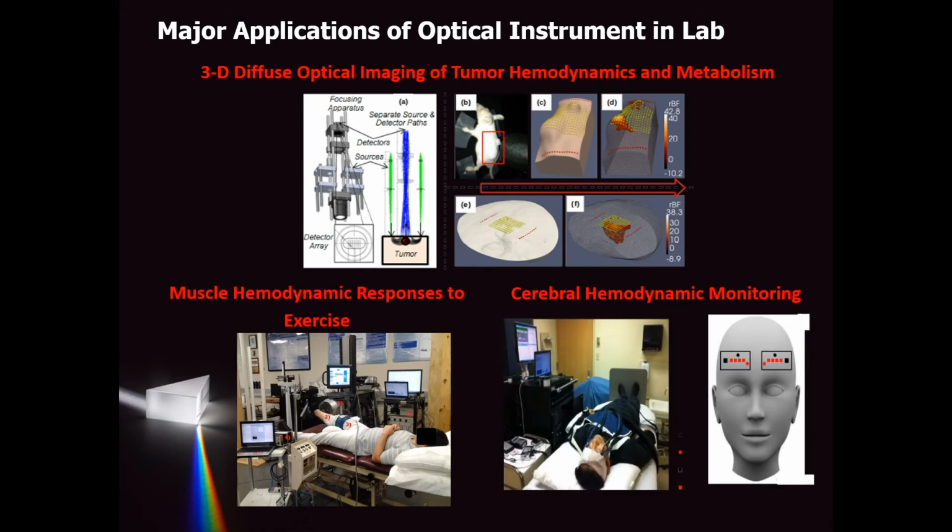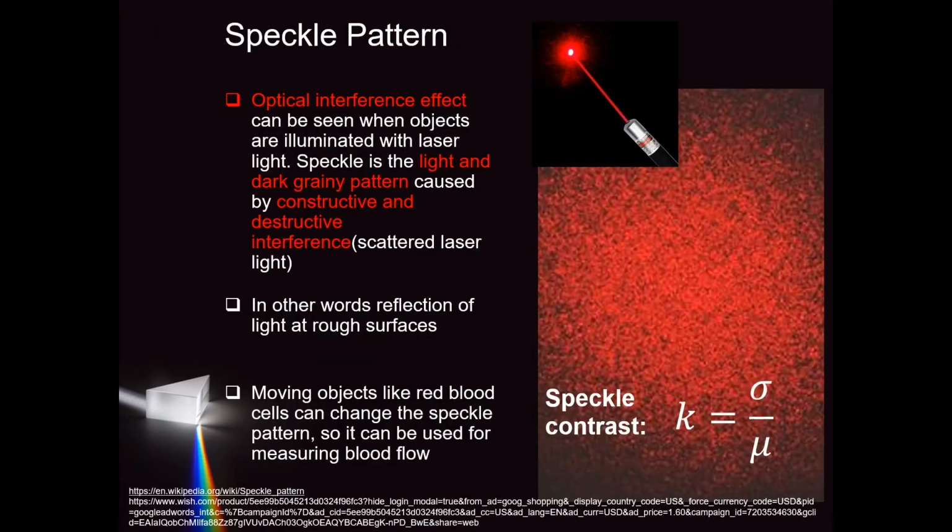And we can also mention cerebral hemodynamic monitoring. The main technique being used in our lab is speckle contrast diffuse correlation tomography and spectroscopy. It's called SCDCT. The underlying mechanism is the utilization of a laser as the light source.